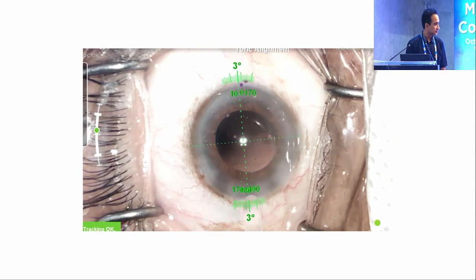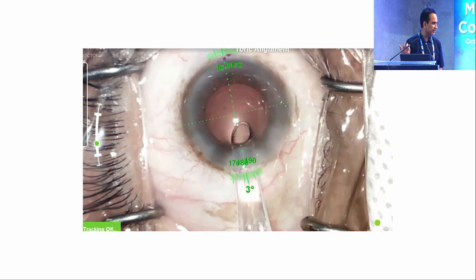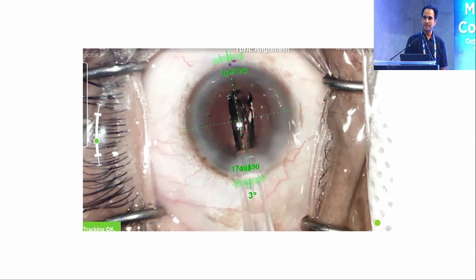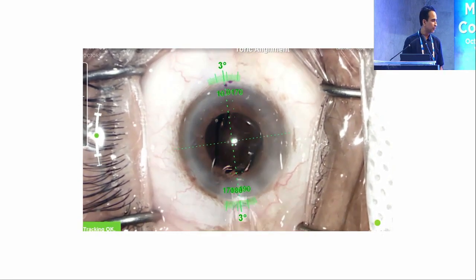There is one which has come with one also. This is a screw injector. Is it coming with a direct press injector? They didn't give. We are using IHANS with a direct press injector. No, they don't have that option. Only screw type they have.